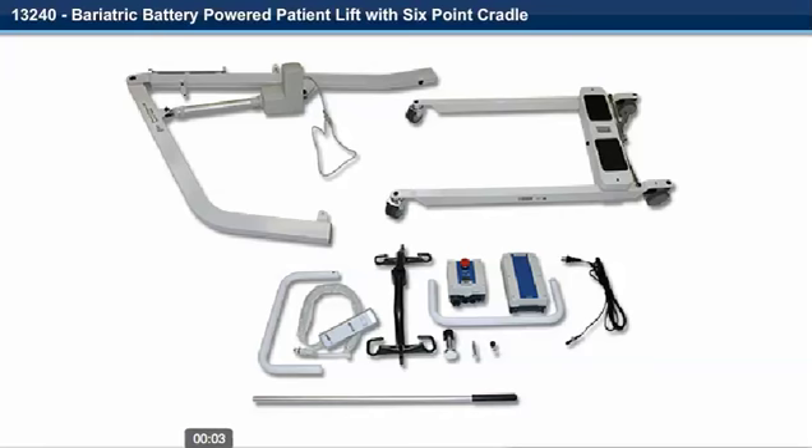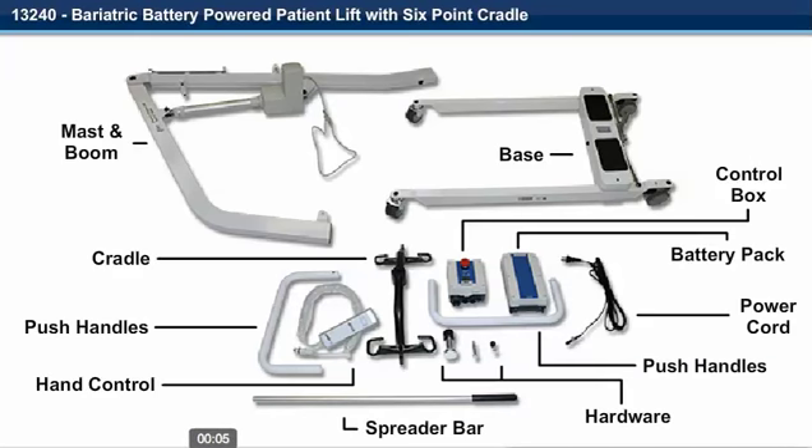Step 1. Unpack the unit. Identify and verify that all parts are present.